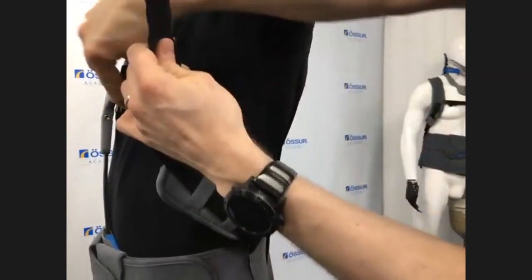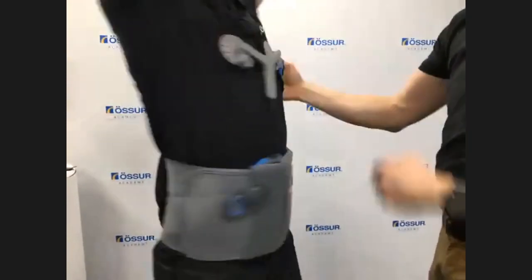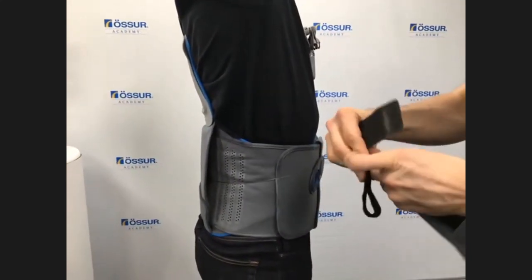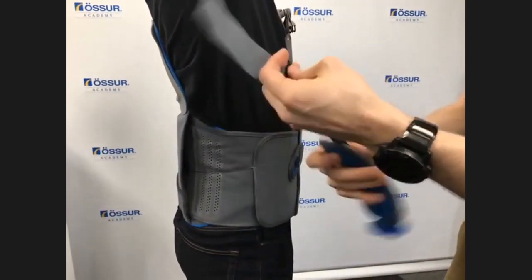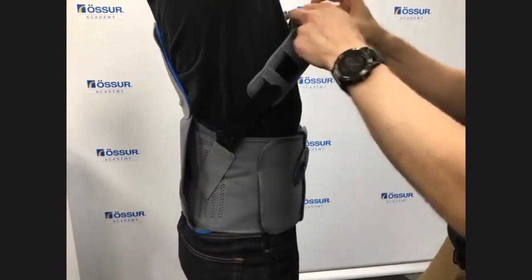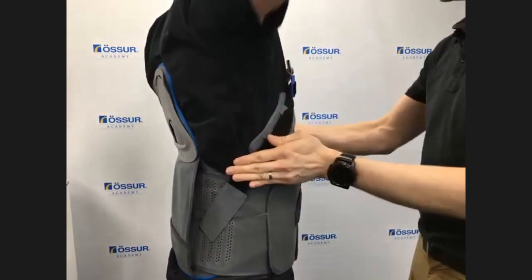So positioning that axilla pad, bringing that round and tightening that up so that we've got it in the correct position there, like that. Spin Pete round, like that, and then we do exactly the same on the opposing side. So I have my strap anchor, and then what I'm doing is adding in the strap to that, adjusting that either side, positioning that posteriorly, and again adjusting it anatomically to wherever we need it. Fasten that in there like that, and then if you spin round, Pete, we're just adjusting that. Hold on, that's great. Just adjusting that and staying in position.